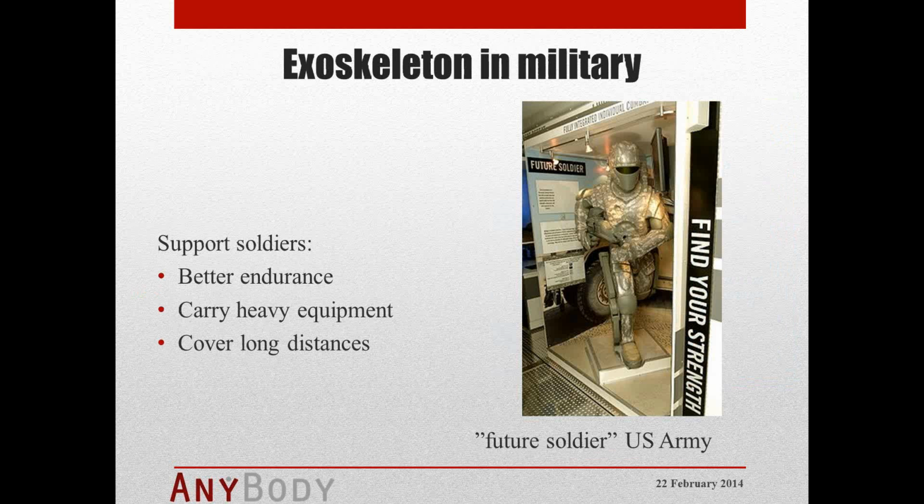This is also very important in the military area. So the US Army also has, of course, several approaches to use exoskeletons to support their soldiers with better endurance, to carry heavy loads, their heavy equipment, and to cover long distances by foot. So these are just some examples.